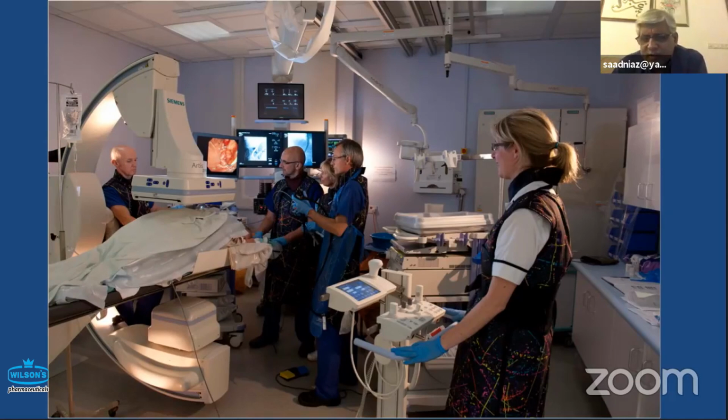This patient underwent ERCP, had a small sphincterotomy and a stent placed. This is a 45-year-old man. The CT scan showed nothing except abnormality at the ampullary area. What would you say? This patient was not jaundiced. Did he really need any ERCP? Should he just have had an ampullary biopsy using a duodenoscope?